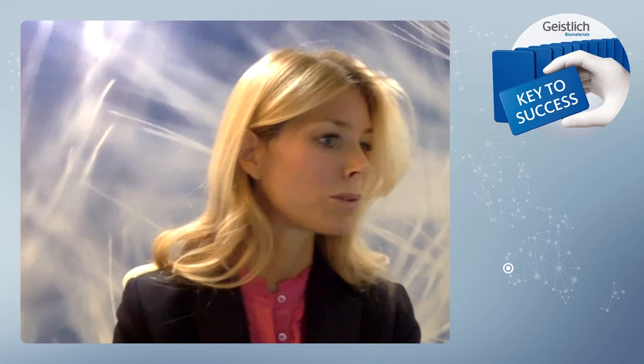So I have a question: when you do the bone augmentation of the lower posterior, where do you place the fixation pin lingually? Do you worry about the lingual nerve? Everything is pre-planned with two diagnostic measures. One is, obviously, the CBCT scan, so you can see exactly where you're going to use the pins. And the second is a 3D reconstruction. I always have the little 3D models that I've shown you in the lecture.